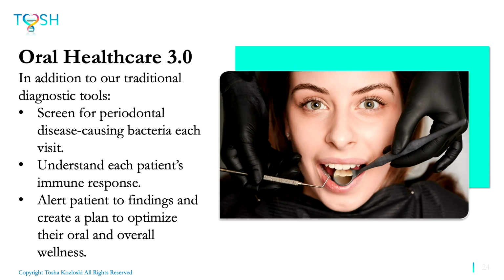So in my humble opinion, I think oral healthcare 3.0, the microscope just allows us to be so much more proactive than reactive. Using these same principles, we can screen patients every single visit to look at what their biofilm looks like. Is there anything swimming in the plaque that we should be aware of? And then we can understand each patient's individual immune system. Does this patient have lupus or Crohn's disease or psoriasis? That's an inflammatory condition. On top of that, are they taking an immunosuppressant drug to decrease that immune response? Now it's like they have a double whammy because they not only have an inflammatory condition, but we're trying to push down their immune system so that it doesn't react to that.